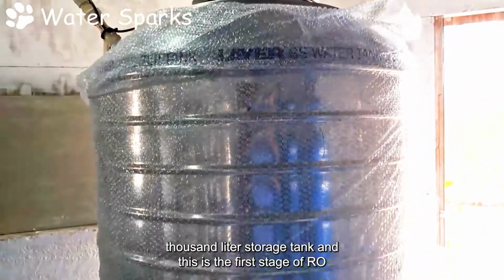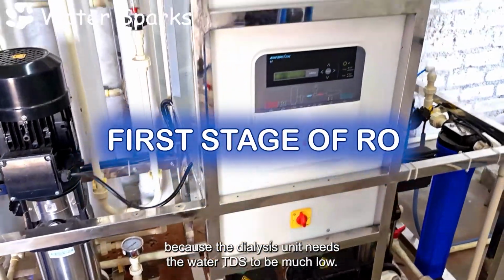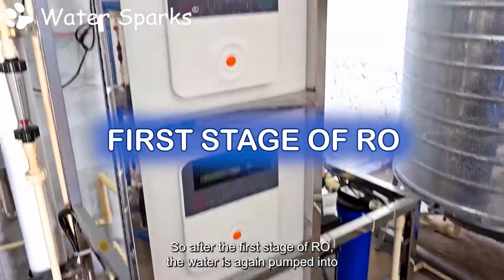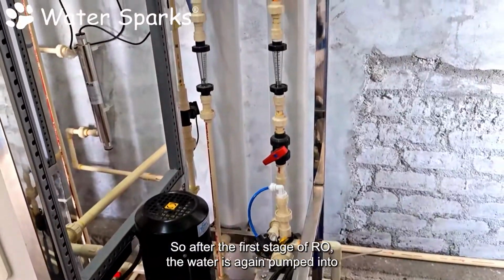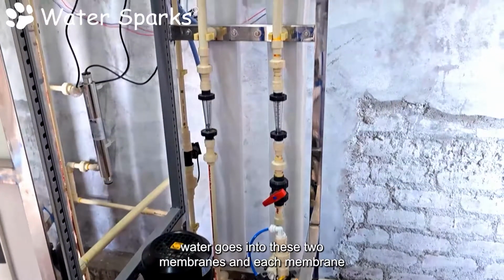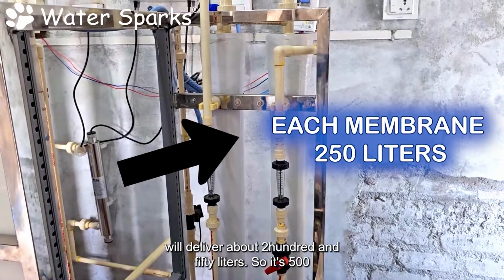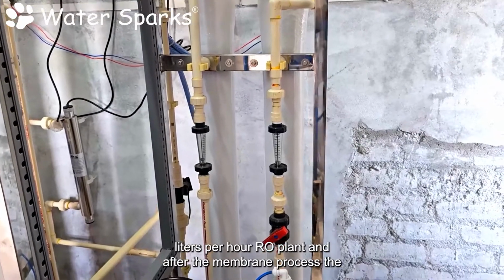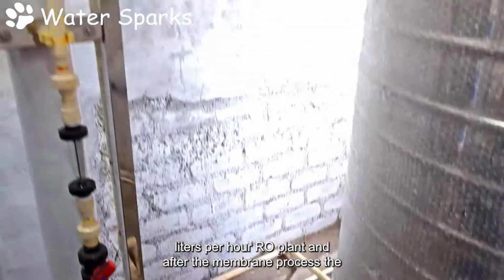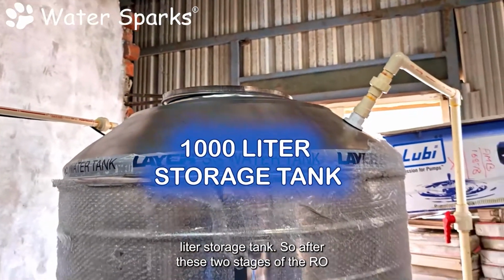this 1,000-liter storage tank. And this is the first stage of RO because the dialysis unit needs the water TDS to be much lower. So after the first stage of RO, the water is again pumped into this motor here, and this is the second stage of RO, and the water goes into these 2 membranes, and each membrane will deliver about 250 liters. So it's a 500 liters per hour RO plant, and after the membrane process, the RO water is stored in this second tank, which is a 1,000-liter storage tank.